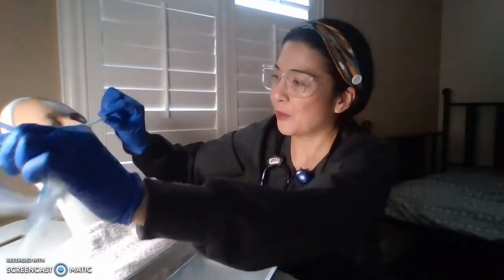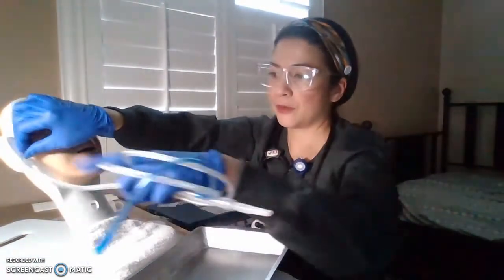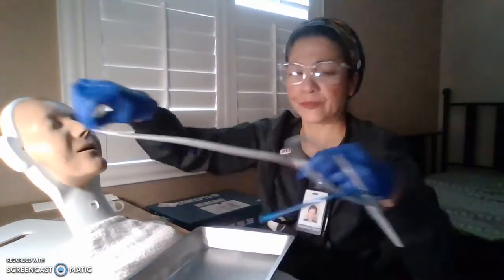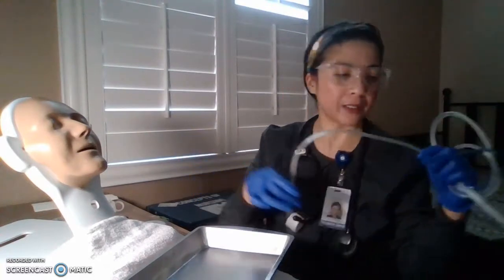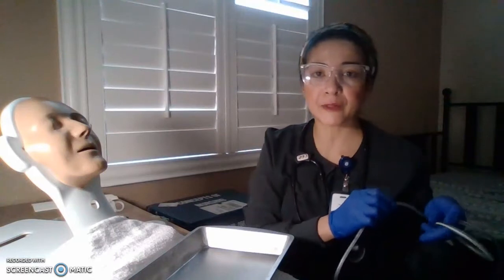First of all, we would start at the nostril like this. All right, going to the earlobe, and then mark it with your hand, and then moving down to the xiphoid process. All right. So I want to inform you this tube is actually marked, but just be smart. I know you may remember and I know you may forget as well.